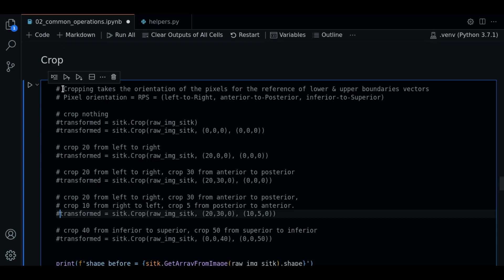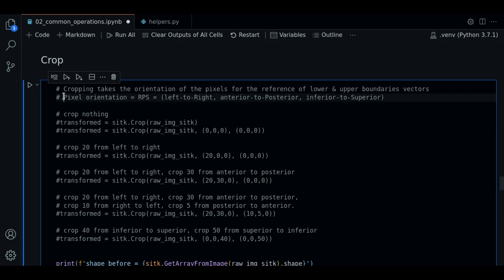So now let's learn how to do cropping. Let's start with some notes. Cropping takes the orientation of the pixels for the reference of lower and upper boundaries vectors. I know this is very technical but let's see.